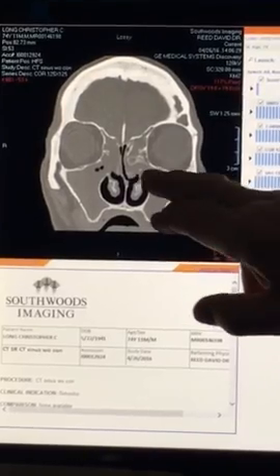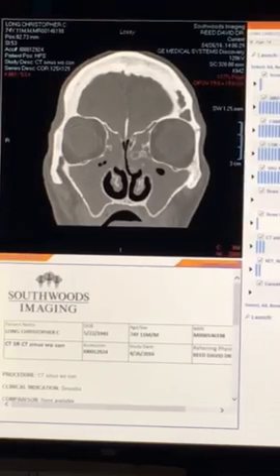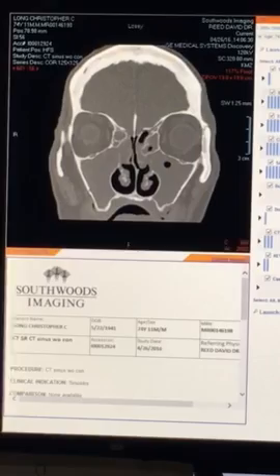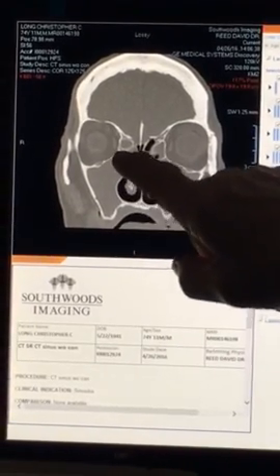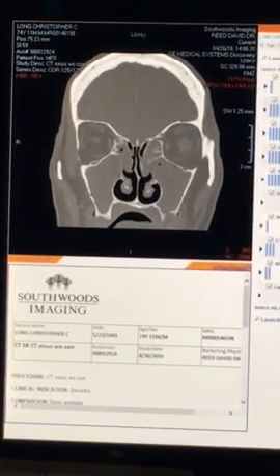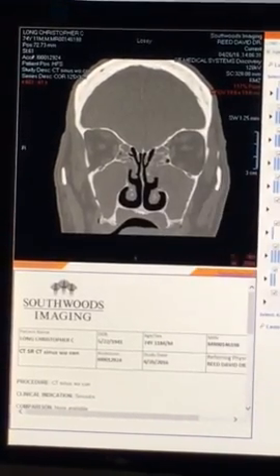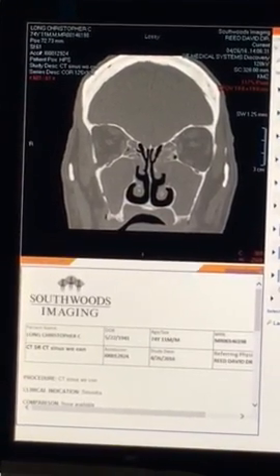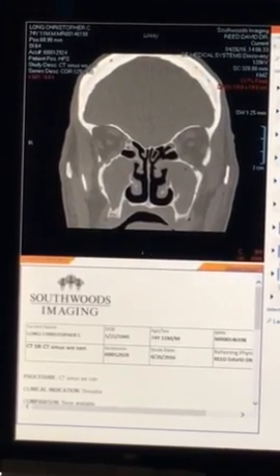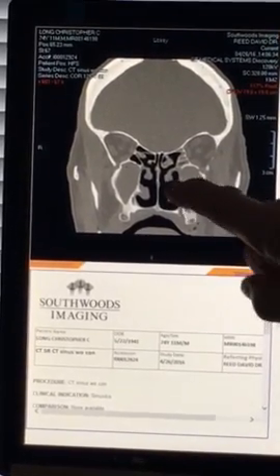As we get back here, this is where the sinus should be draining into your nose. And it looks like it may be okay here on this side. The other side, we haven't quite gotten to that point yet. But look, it's not draining. There's something blocking it. I'll bet you that's a big polyp that we're not seeing here in the office. As we go back, you can see how full these sinuses are. Sometimes your polyps will shrink down just with cortisone, but you've been on plenty of cortisone and it's not doing much. Now we're back at the end of your nasal passage.